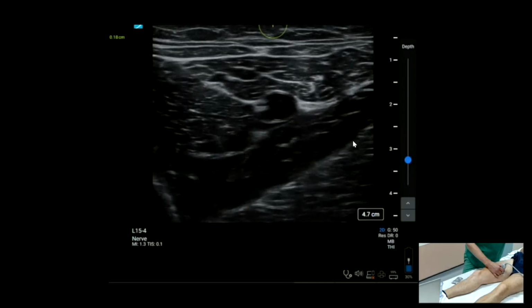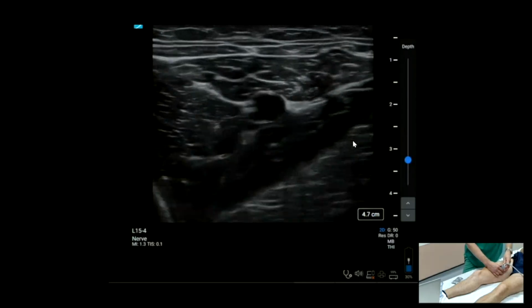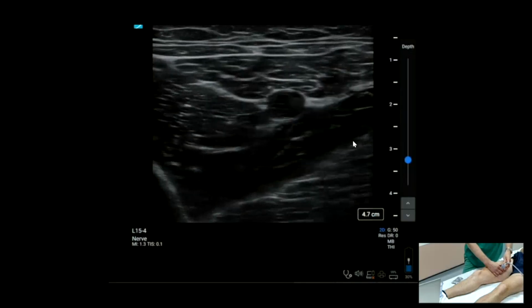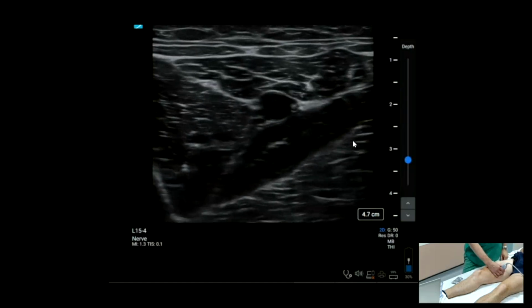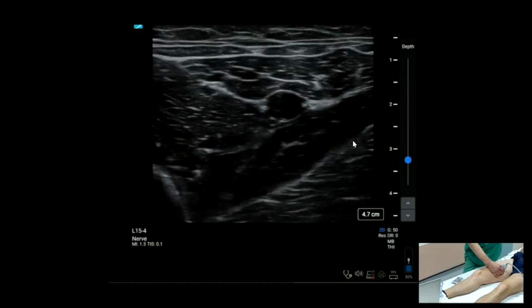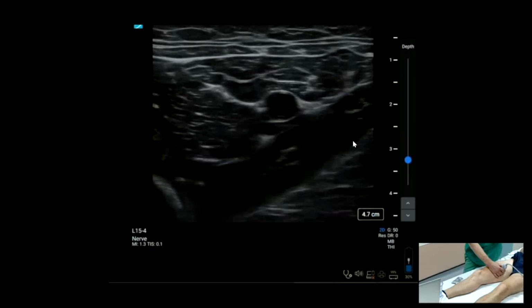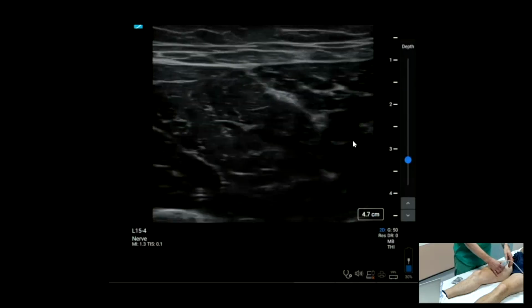So those are the two key endpoints really for a femoral triangle block. But don't worry if you can't see the nerve to vastus. If you just were to get to this point next to the saphenous nerve and get very well circumscribed spread, and you put in 10 to 15 mils, you should get retrograde spread up, which should reliably block the nerve to vastus medialis anyway.